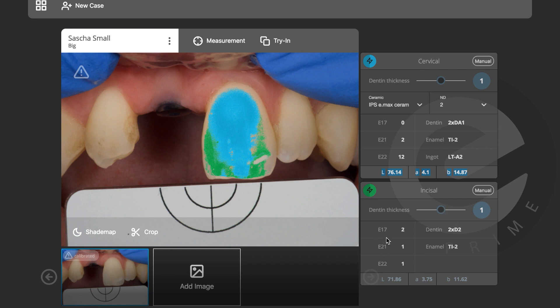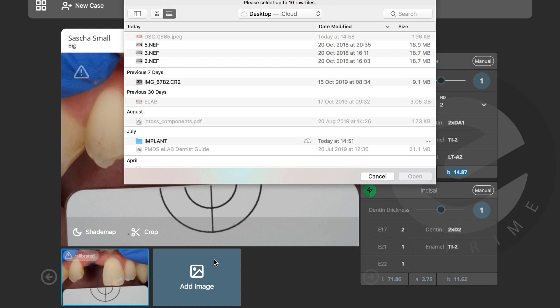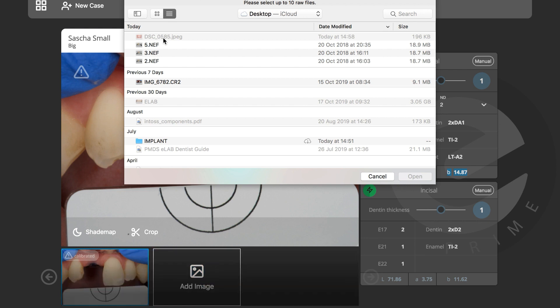I'll now sit with my ceramic and brush and layer the first layer. Then I wait 15–20 minutes for the furnace and we're done. I can also do a digital try-in. I've finished this crown layer, so now I'll take a picture of the fired tooth to show you the next step — this is picture number two.